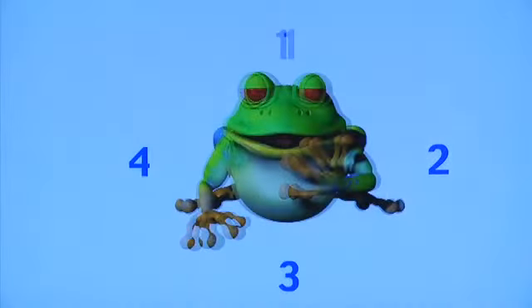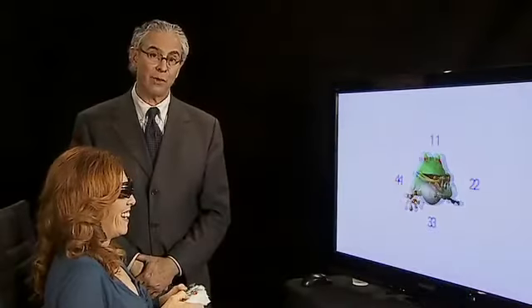Yeah. Great. These techniques can also be done with regular stereoscopic targets. And frog is an example where there are numbers 1, 2, 3, and 4. Only one of the numbers is popping out. Kelly, make a response to the number that's popping out. And the task is similar to that of a random dot stereogram, except using a stereoscopic target that has contour to it.